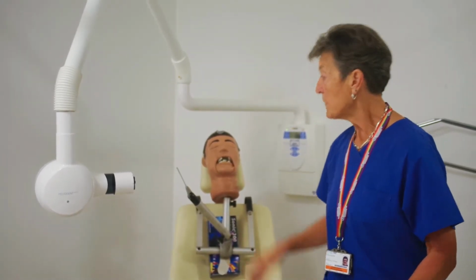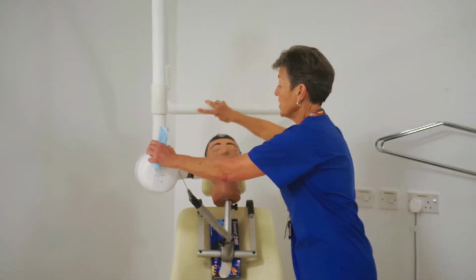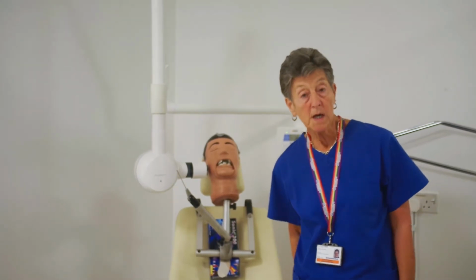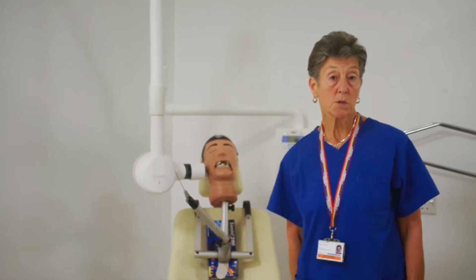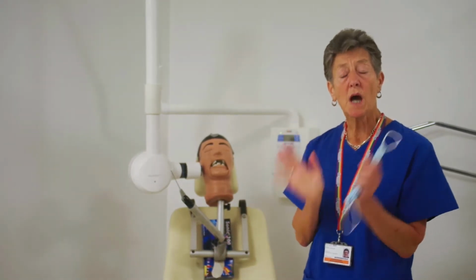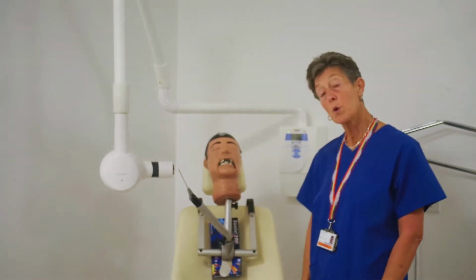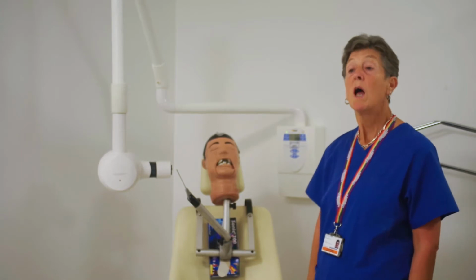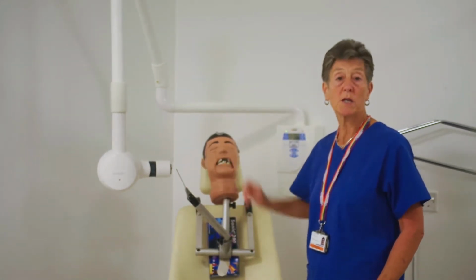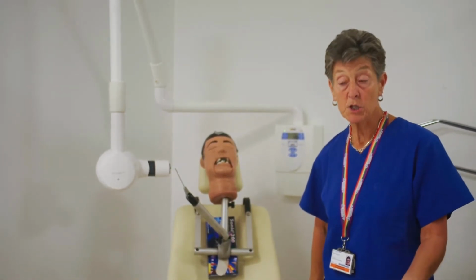Also, we make sure that when we are going to take the radiation, the X-ray tube is as close as possible to the patient, because if you remember, there is something called the inverse square law, and remember also that there is a divergent X-ray beam. So the further you have the X-ray beam away from your patient, the bigger area it covers, but also due to the inverse square law, a quarter of the radiation will probably get to your patient, which means that you'll get a very pale image.